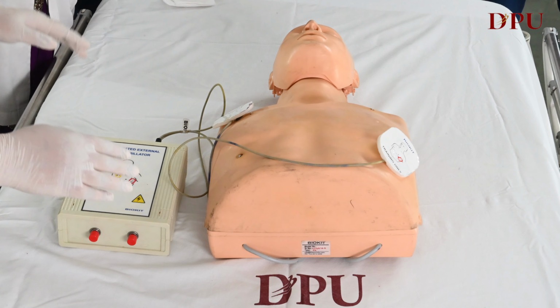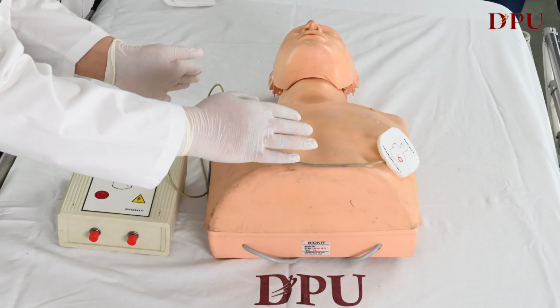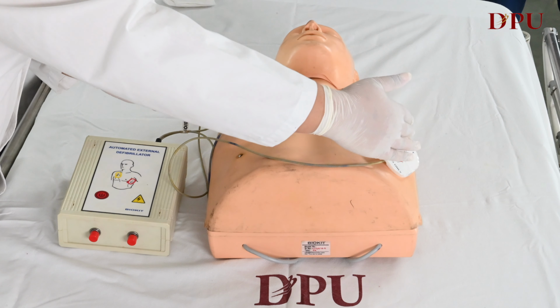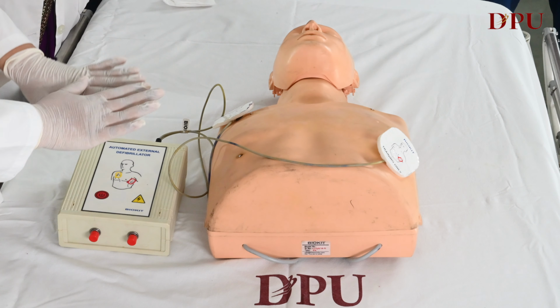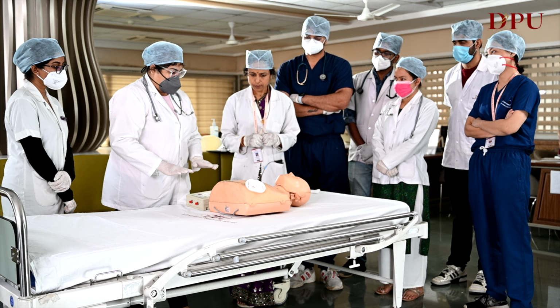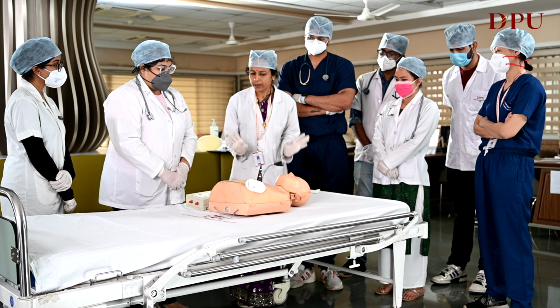Very good. And then I'll apply the 2 pads, one in the infraclavicular fossa on the right side, and one on the apex on the left side. Very good. And then I'll ask for the person to stop the compression for analysis. So the machine is talking now. Shock is advised.